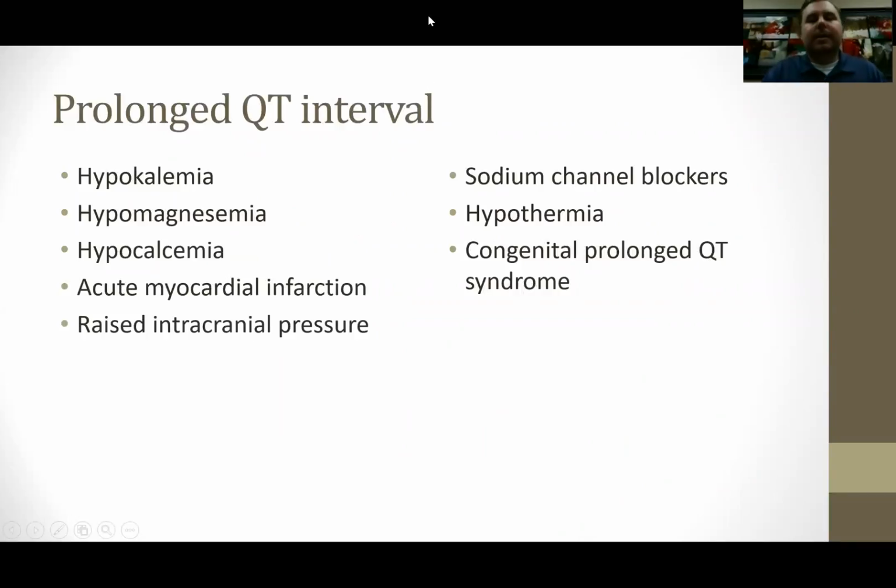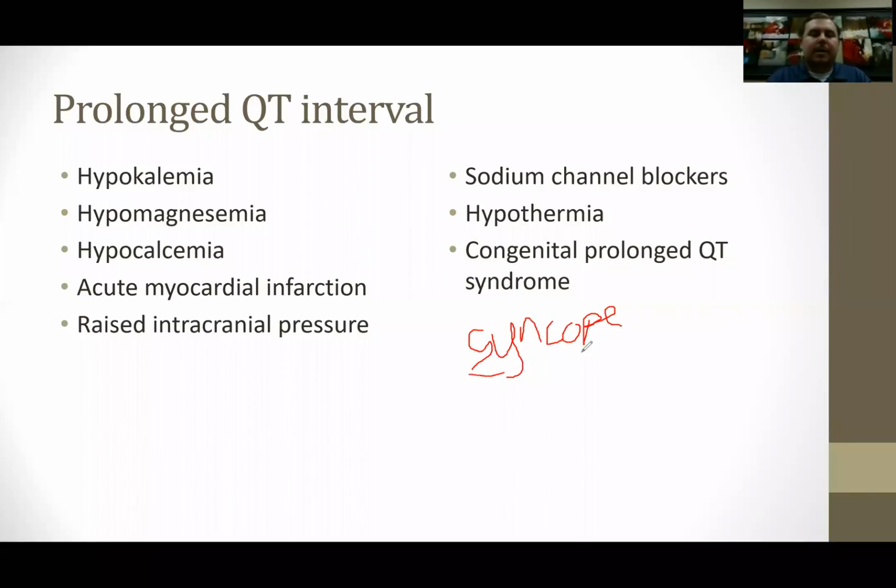There's also syncope, which I thought was on here. So what syncope means is anytime you run a patient that either passed out or nearly passed out, there's reasons to run a 12 lead. So syncope or first time seizure.